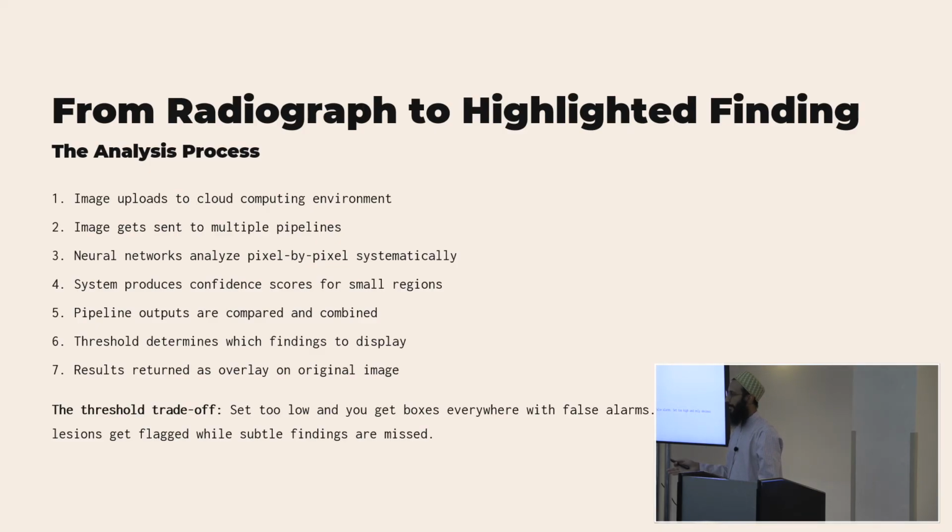What percentage is your model currently in the US? I think it's the tops. I think it's 75 plus. It's been a couple years, so I've forgotten. But yeah, in order to get it approved by the FDA, we had to run a clinical trial at every single confidence level. Can clinicians set it up wherever they want, or is it preset? It's preset, because I'll get into it, but that's what's been cleared by the FDA. Okay.